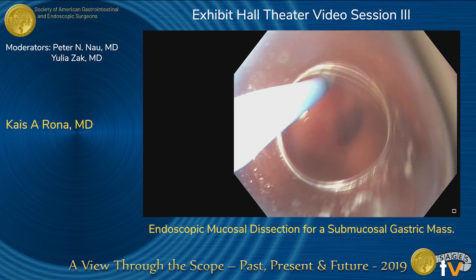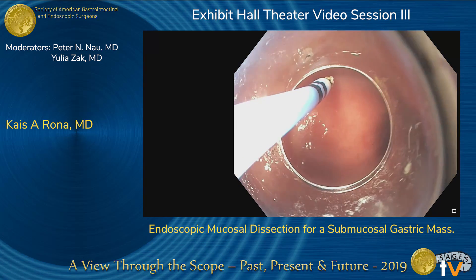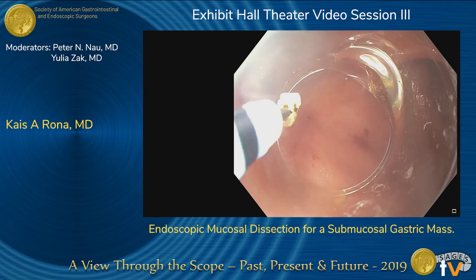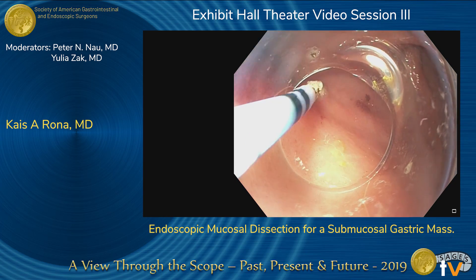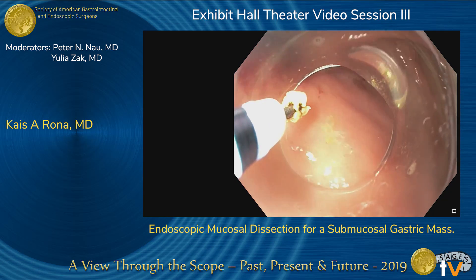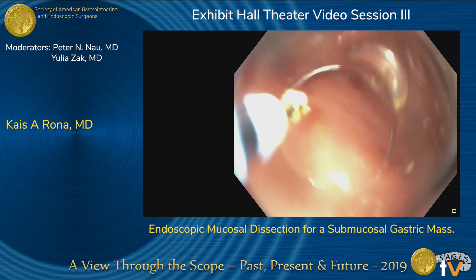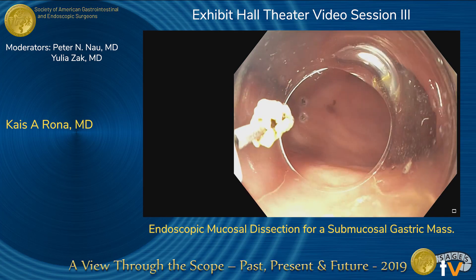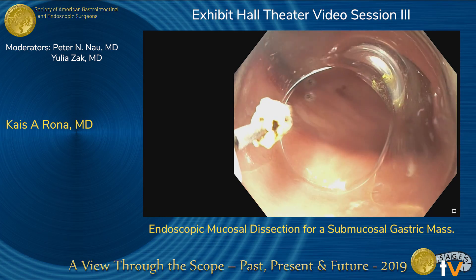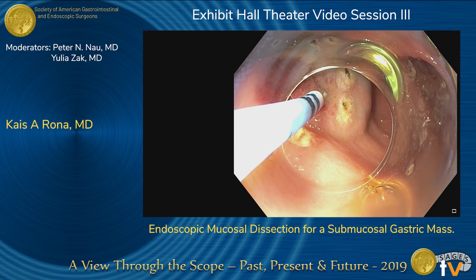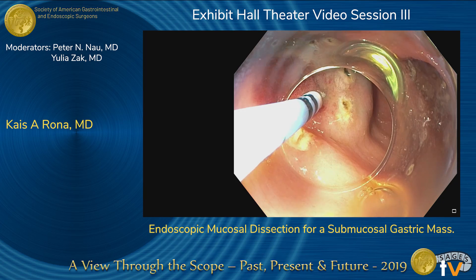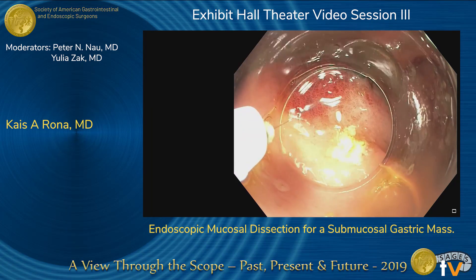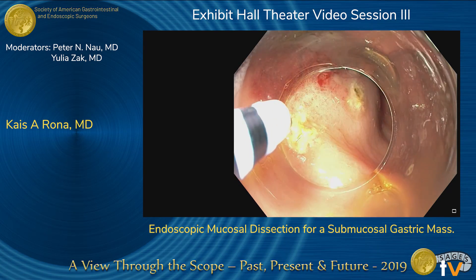We do this circumferentially. What's important is you want to maintain about a 1- to 2-millimeter margin of normal tissue between your markings and the actual mass. Once we've marked circumferentially, we perform our lift, as you can see here. We perform the lift with diluted methylene blue, though other commercial gels are available.